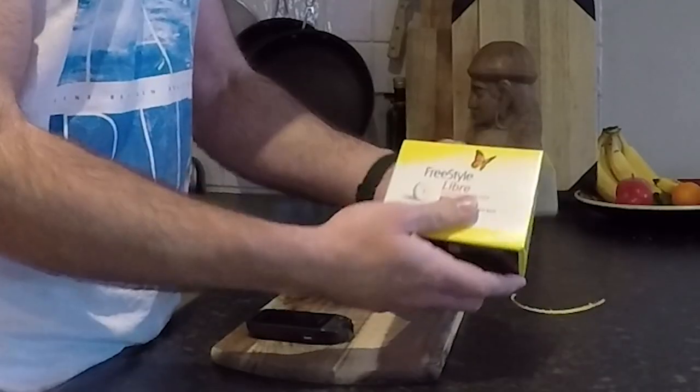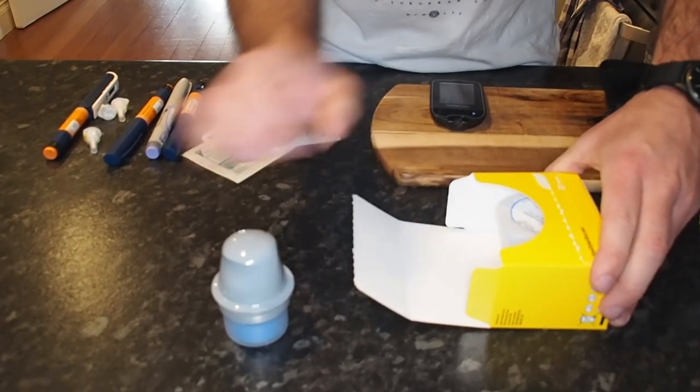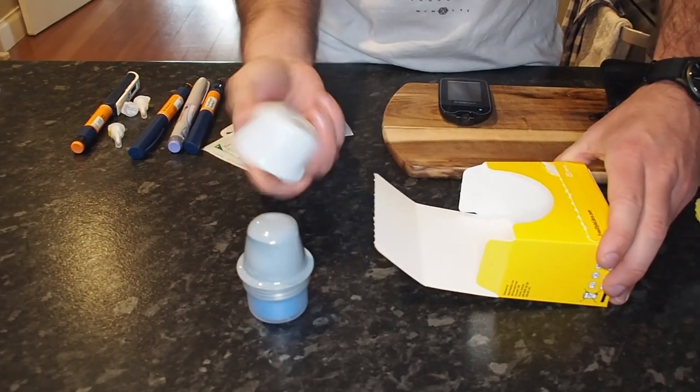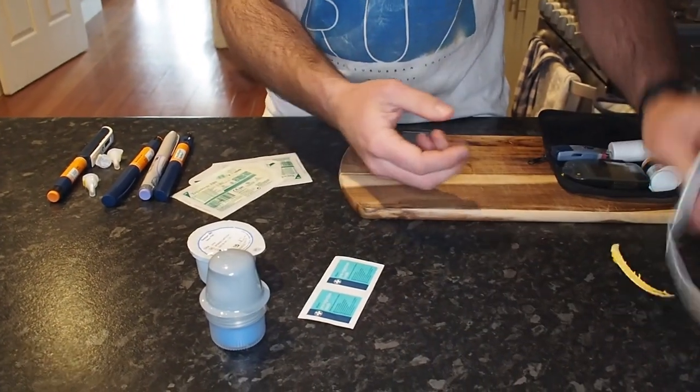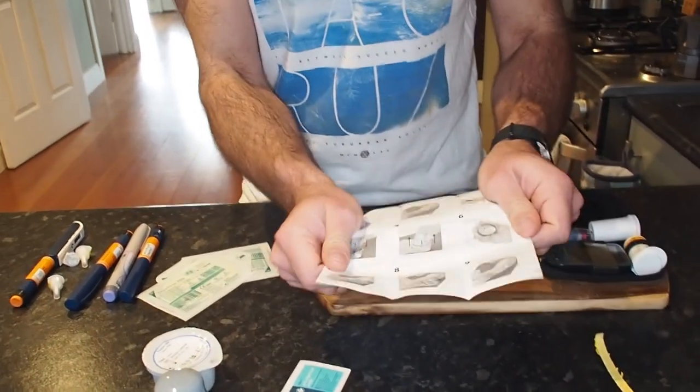Alright, let's get into it. This is the Freestyle sensor — the unboxing. Alcohol swabs, packaging, and we have the instructions. So this is where I have to put it on the back of my arm. Alcohol swab, open up.